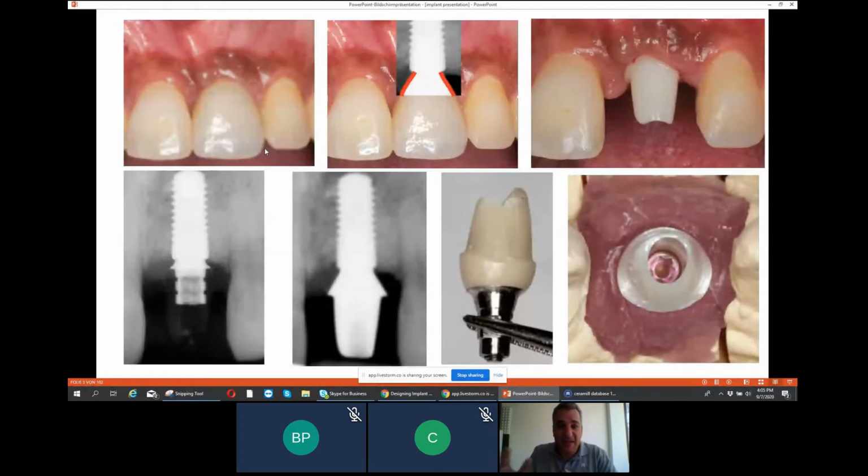So here, let's start with this picture. In most cases, the problems between dentists and labs when using implant cases will be these centrals. Because as you can see in the first picture, we have the final restoration, regardless of what we have under the gingiva. So to get this final shape and this emergence profile here, we need to have a customized abutment. We cannot work, as you can see in this picture, with a cylindrical abutment.